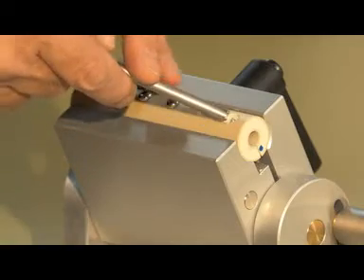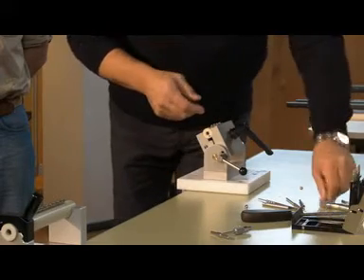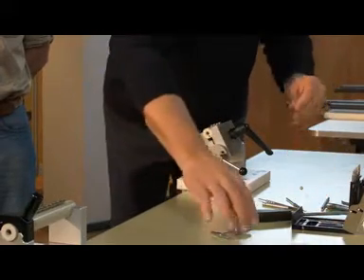When you use the instrument, go all the way through the near cortex. We have enough room for the instrument with which we will now extract.